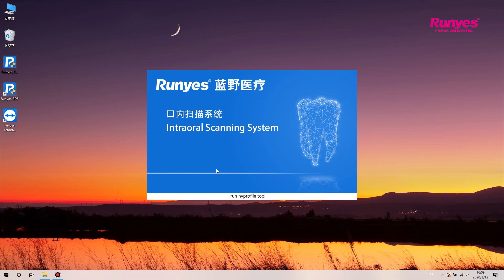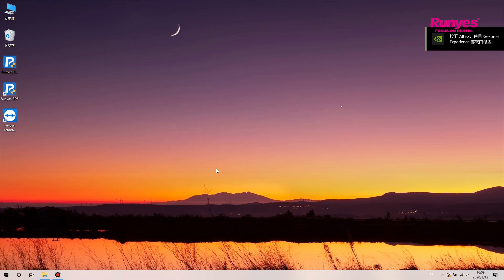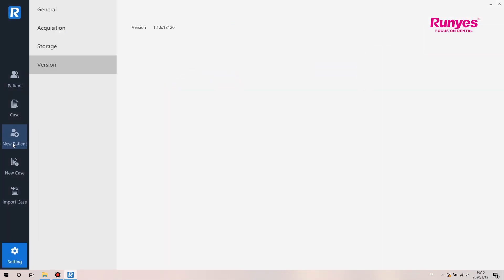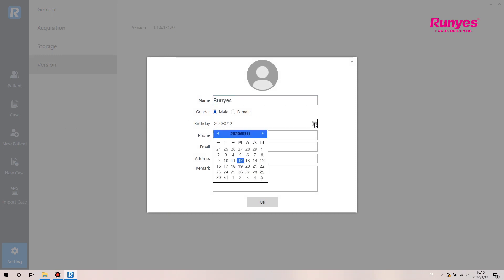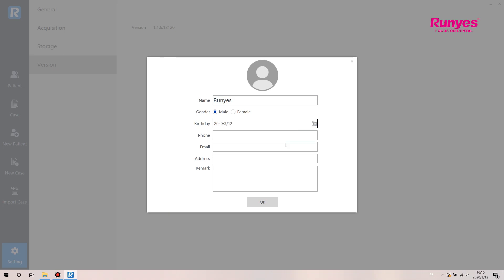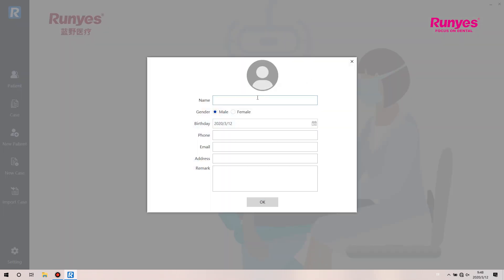Software introduction. Click the new patient icon to create a new patient file and enter the corresponding information for the patient. Click the new case button and select the patient to enter to the next menu. You can also create a new patient here.